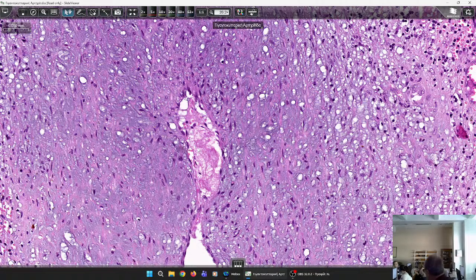So, we understand that arteries are not only occluded by atheromatous plaques which have become complicated and eroded and thrombosed, but an immune inflammation and arteritis may also occlude the lumen through thrombus formation, because since the inner layer is thickened again, there is not enough blood supply.